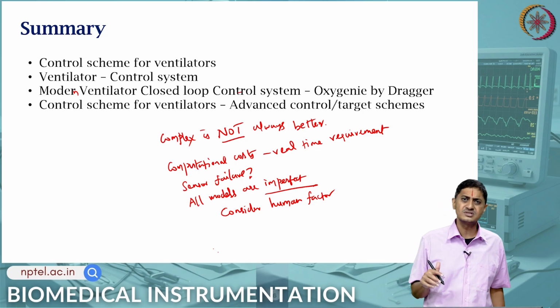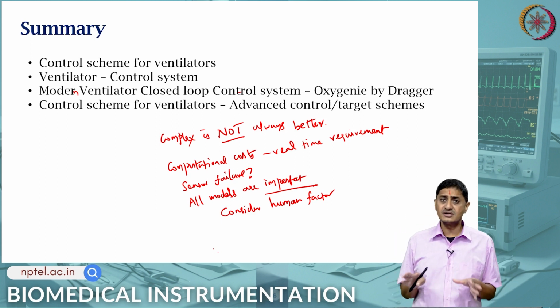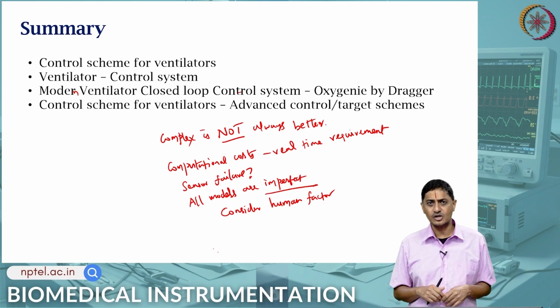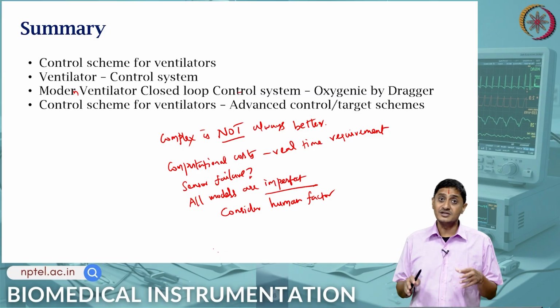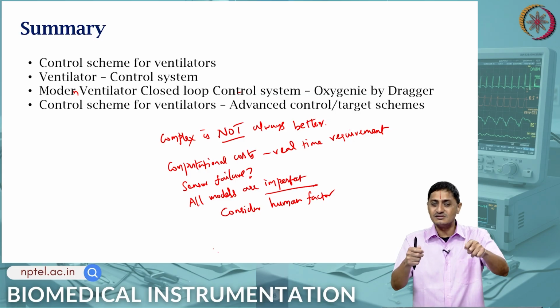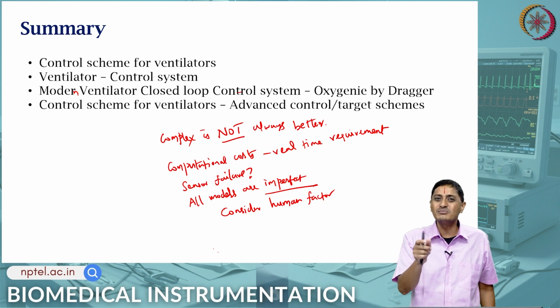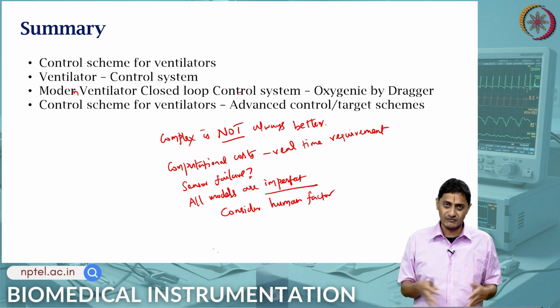Remember, what is our goal? Our goal is to have, in the case of automatic or mandatory control, something like a car that is driving itself, like the self-driving, autonomous cars of today. They drive by themselves, the passenger is not doing it, they are just sitting and the car is driving. But I am talking about the case where the patient is providing some effort, like in the case of power steering. I am attempting to turn and then the turn happens further. It is taking cue from the driver's effort to turn, is it not? That is power steering or cruise control, for example.